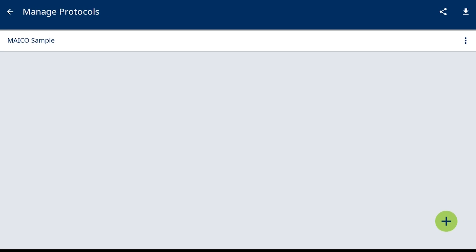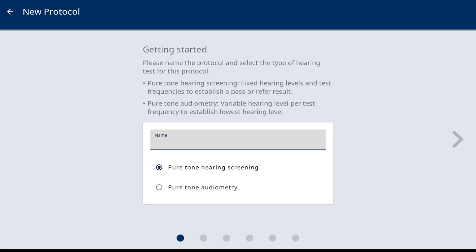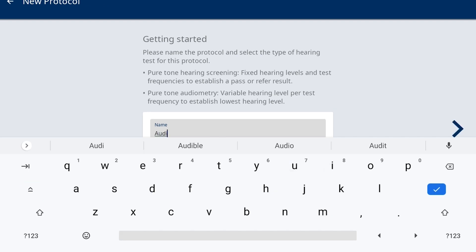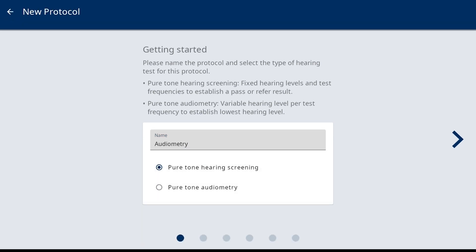Add a new protocol by selecting the plus icon at the bottom right corner. The first screen is to enter the name of this protocol and select the test method preferred. The test method options include pure-tone hearing screening and pure-tone audiometry. Once a name is entered with the onboard keyboard and pure-tone audiometry protocol is selected, use the right arrow to move to the next screen.